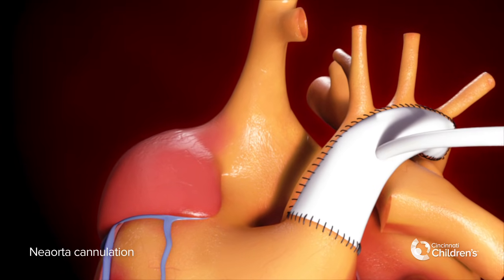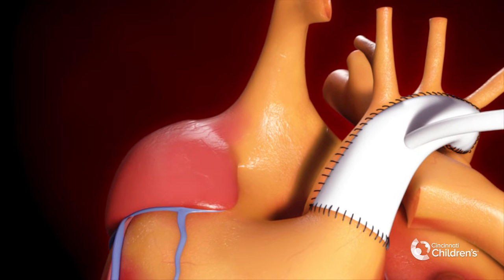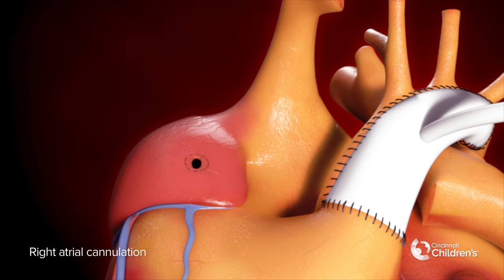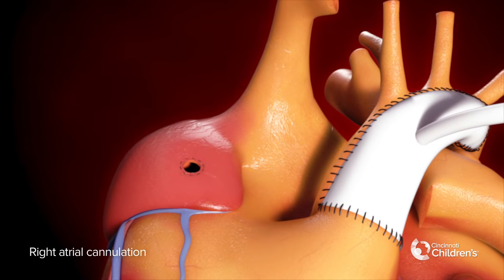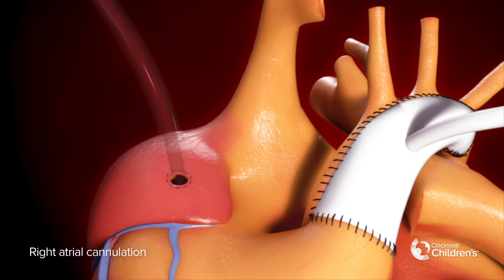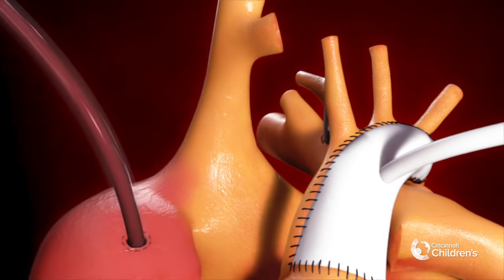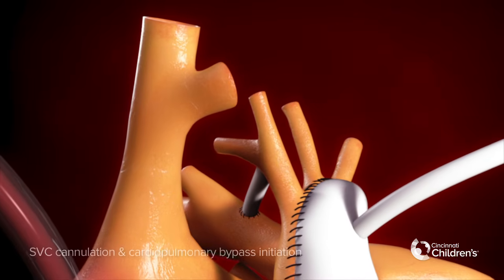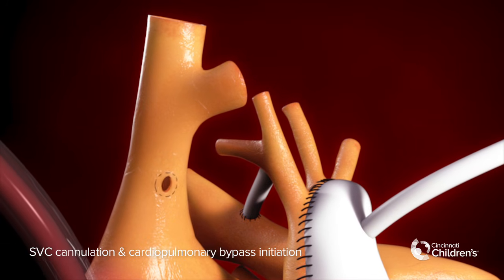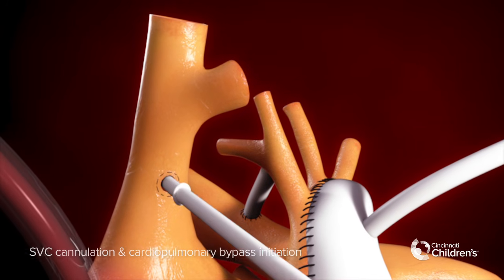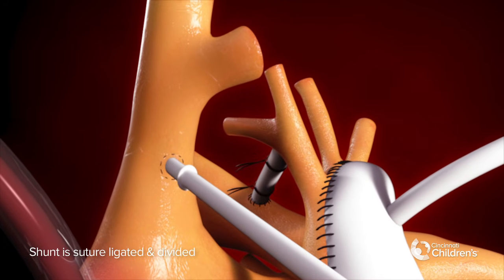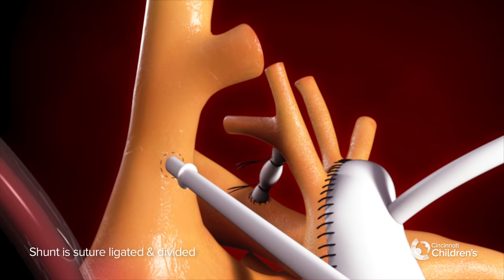Neo aortic cannulation, right atrial cannulation, SVC cannulation and cardiopulmonary bypass are initiated. The BT shunt is then suture ligated and divided.